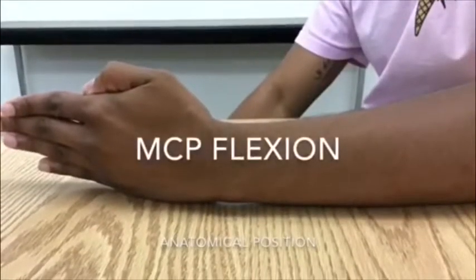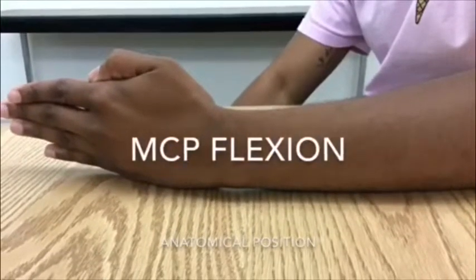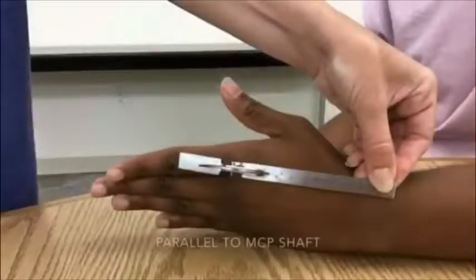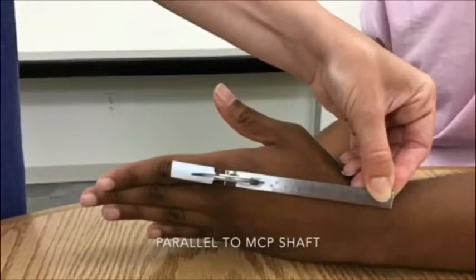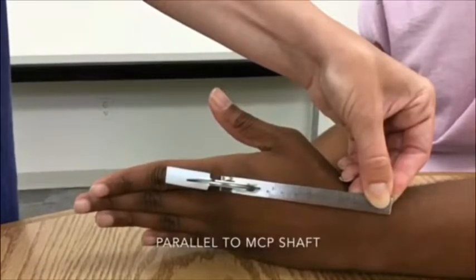To measure metacarpophalangeal joint flexion, have the patient sitting with their arm on a table in anatomical position. Place the axis of the goniometer on the posterior aspect of the metacarpophalangeal joint, with the stationary arm parallel to the longitudinal axis of the metacarpal.